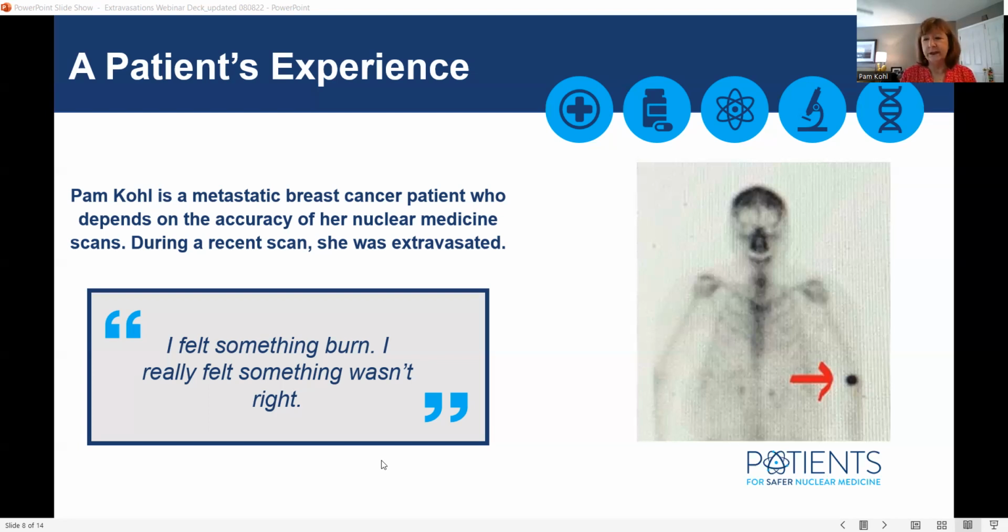All of those treatment decisions are based on the 3-month scans. So if I have a scan and my current tumors, or METs as we call them, grow, or if I have new METs, then we know that my treatment is starting to fail and we need to rethink what we're doing. So that's why this is so important.